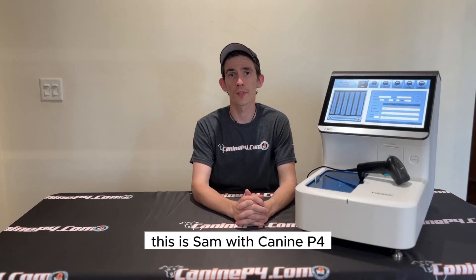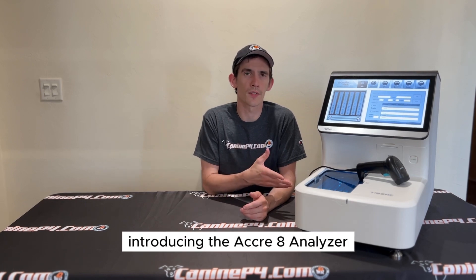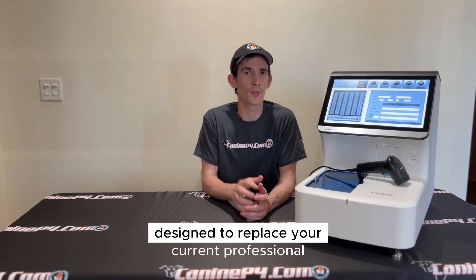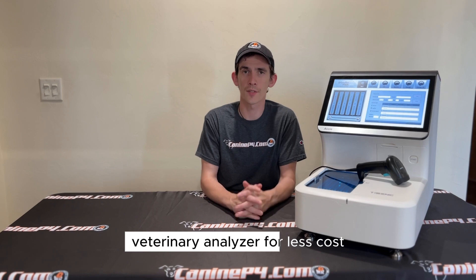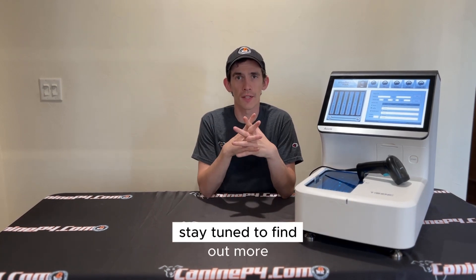Hey everyone, this is Sam from Canine P4. We have some super exciting news. Introducing the Accre 8 analyzer, designed to replace your current professional veterinary analyzer for less cost, less hassle, and much less maintenance. Stay tuned to find out more.